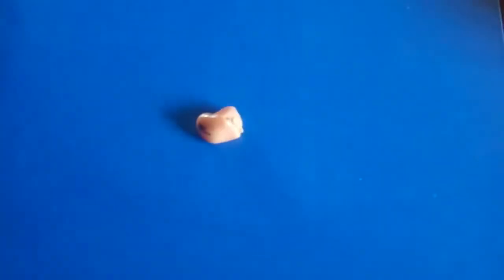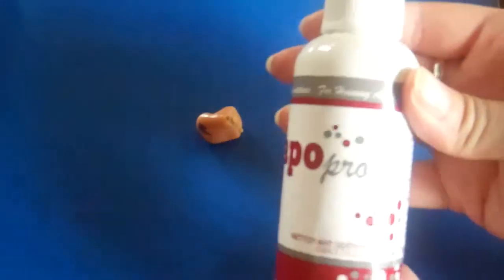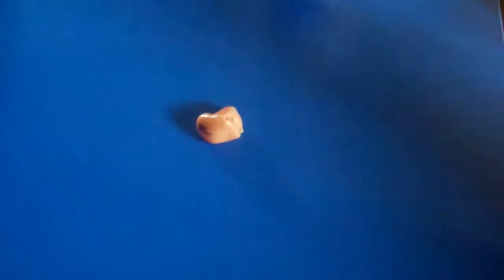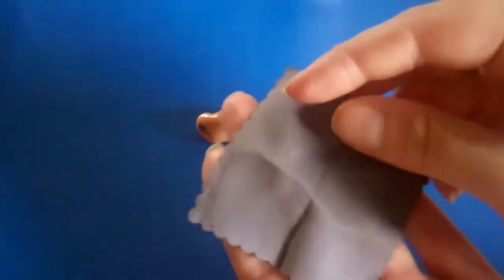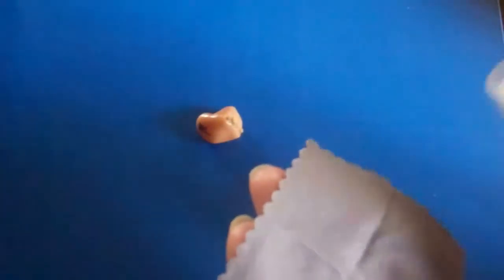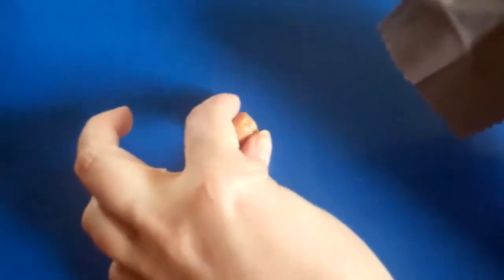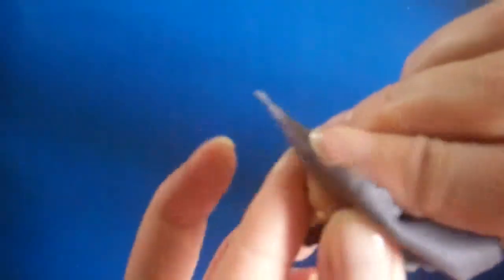So first, let's look at our custom hearing aid. The number one thing we ask that you do every single night is wipe off your hearing aid with our antibacterial spray. What you do is you take a small cloth or a piece of tissue and spray once or twice onto it. Then you're going to take your hearing aid and wipe it off. This is to ensure no germs or bacteria get into your ear from the hearing aid.